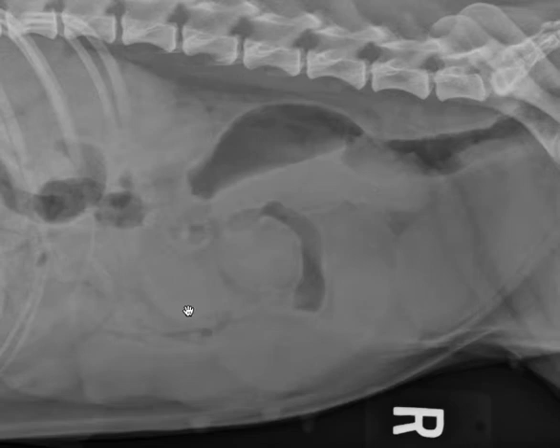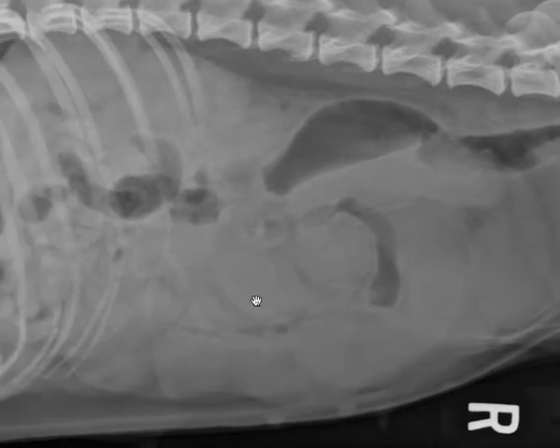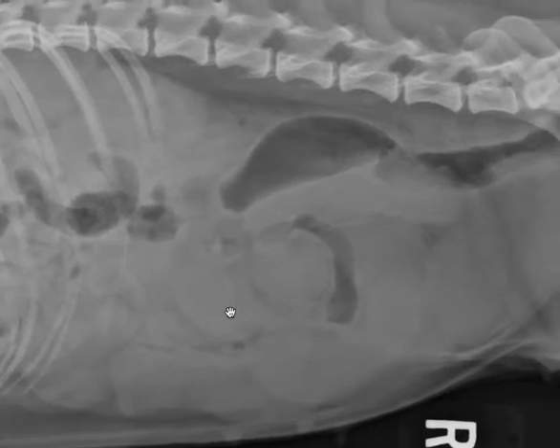to watch this video. Recently, if you've been following us, we have looked at various gastrointestinal cases and discussed a lot about small intestinal size and other imaging features that might help us to determine if a patient may have an obstructive lesion. As part of our systematic approach, of course, we have to consider all organ systems.